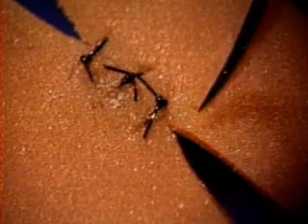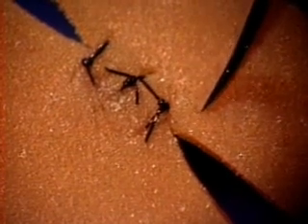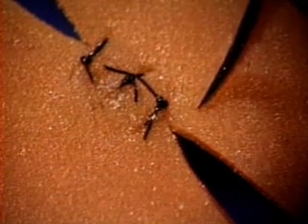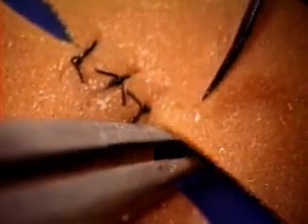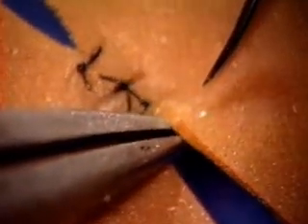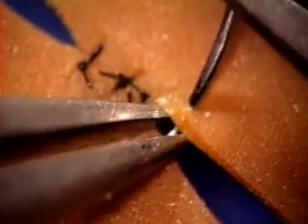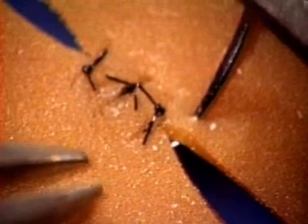Bring in the needle and pick the spot where it's to enter. The distance between the entry point and the edge of the tissue should be about equal to the thickness of the tissue. Now come under the tissue edge with the left hand forceps and raise the tissue up toward the needle, everting the tissue at the moment when you push the needle through. Do not let go of the needle at this point.